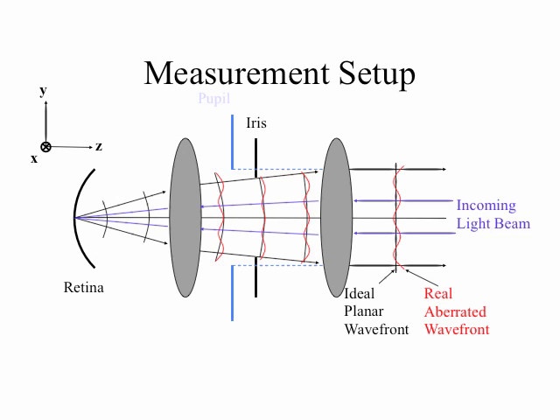Since the cohort of photons at this point describes a section of a sphere with a larger radius of curvature, 3 times the radius of curvature. The radius of curvature now is 3 millimeters rather than just 1. The curve of that sphere is much more gradual. It's a much flatter sphere than the sphere with a radius of curvature of only 1 millimeter.